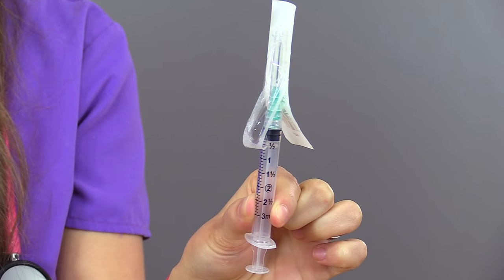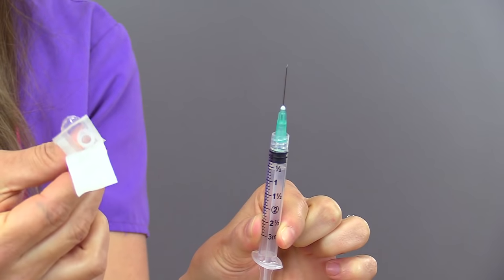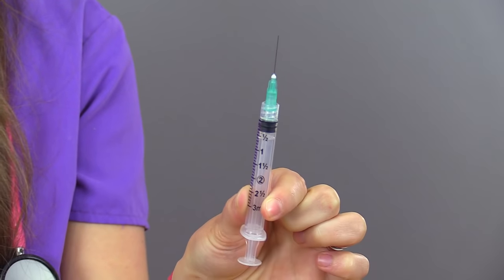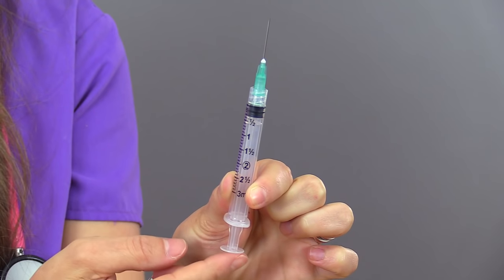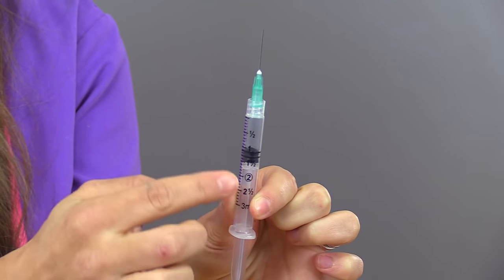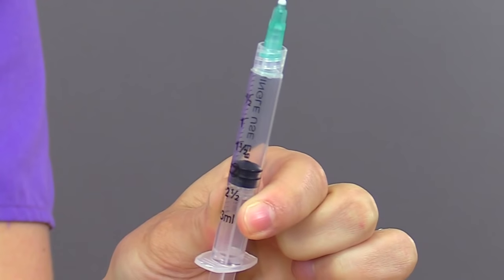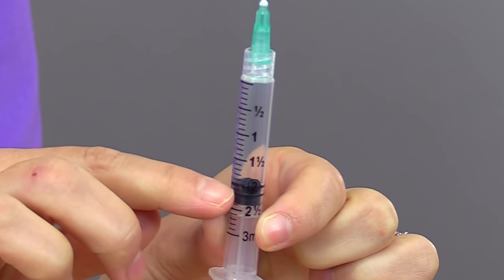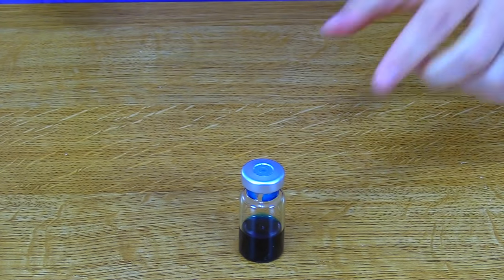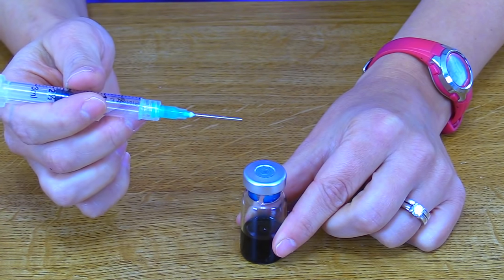To do this, hold your syringe at its barrel, then remove the cap and its packaging in one smooth motion. Keep the cap inside the packaging and put it in a secure location for later. We're ready to instill the air — carefully pull on the plunger phalange, pulling it back while looking at the markings on the syringe. Since we're giving two mls of medication, pull back to the two mark, making sure the plunger seal lines up with the two. Now we have two mls of air. Hold the vial steady on a flat surface with your non-dominant hand, and hold the syringe at its barrel with your dominant hand.